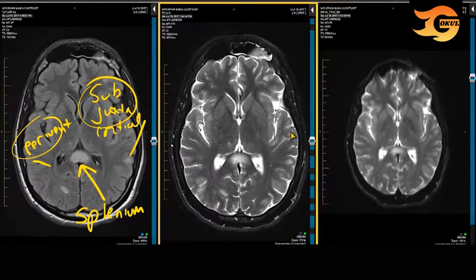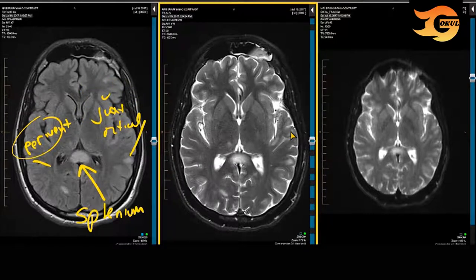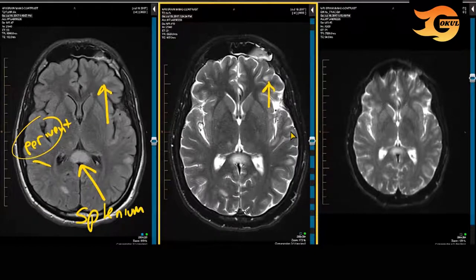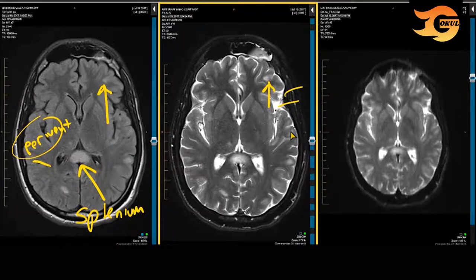If you look at this area of demyelination in the subcortical white matter of the left frontal lobe seen on the FLAIR image, you can see how that might be mistaken for CSF space on a T2-weighted scan, which is why FLAIR is generally relied on most in the supratentorial region.